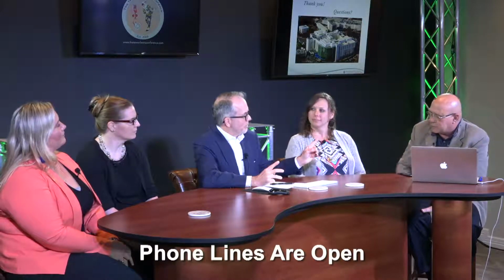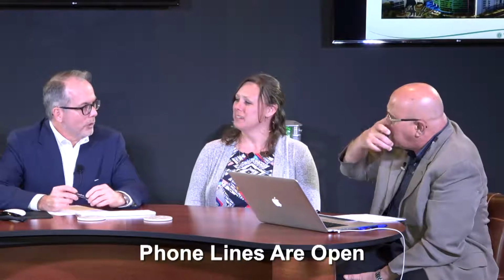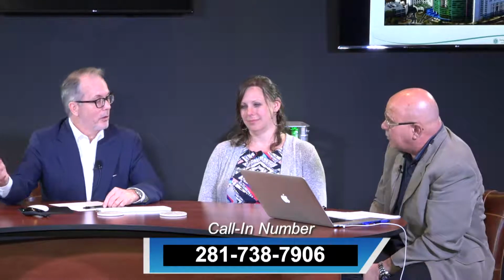But let's back up a second. I want to take you off the hot seat for a second. I think there are many models for ECMO management. One model is perfusion. There's no question it places a significant drain on the ability to provide the other perfusion-related services if perfusion is sitting ECMO 24/7. My favorite saying is we're one epidemic away from not being able to provide care. It's just simple math. The other model is a nurse/respiratory therapy model with critical care oversight. Those models exist, and in some institutions they seem to work as well.